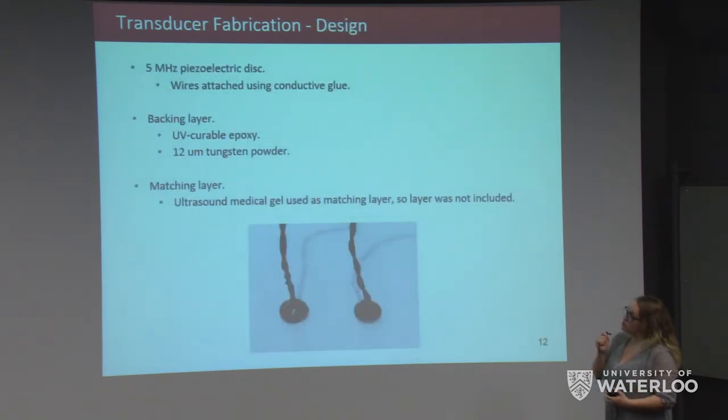We purchased the 5 MHz piezoelectric disc and attached wires to the electrodes using conductive glue. For the backing layer, we used a mixture of UV-curable epoxy mixed with a certain volume ratio of 12-micron tungsten powder. For the matching layer, we did not fabricate one; instead, we purchased ultrasound gel and used it as our matching layer.